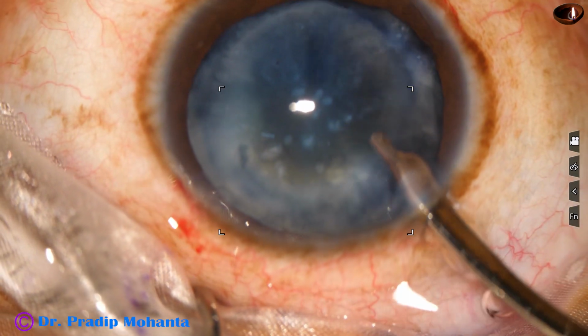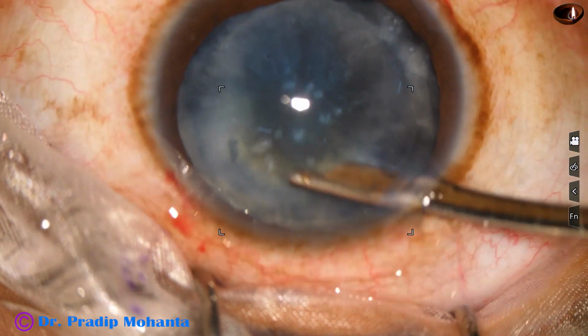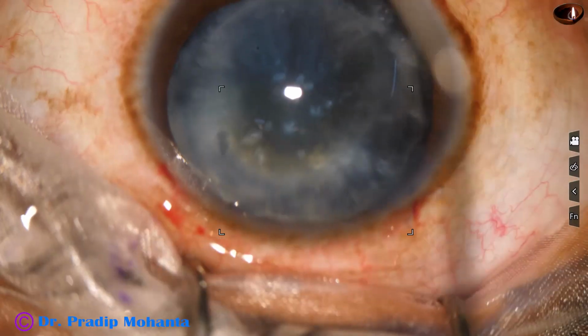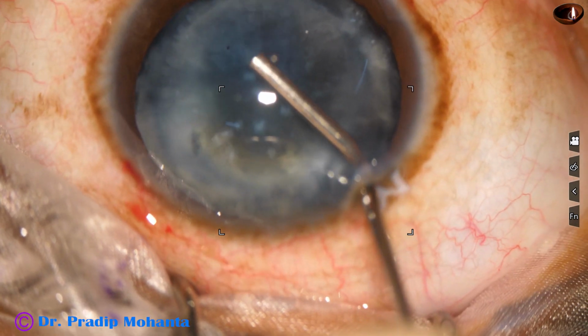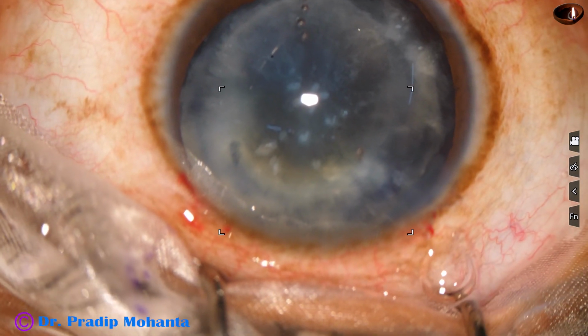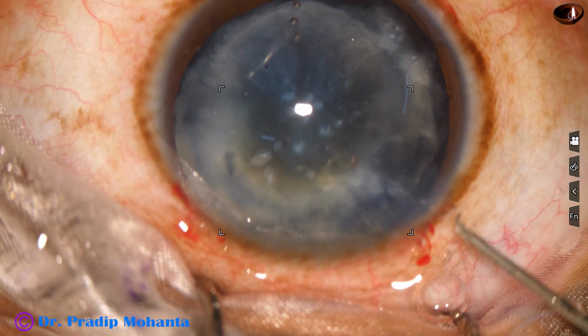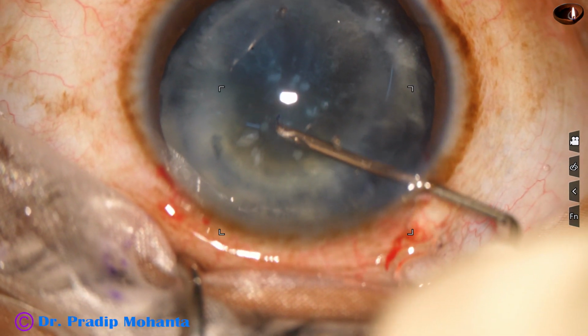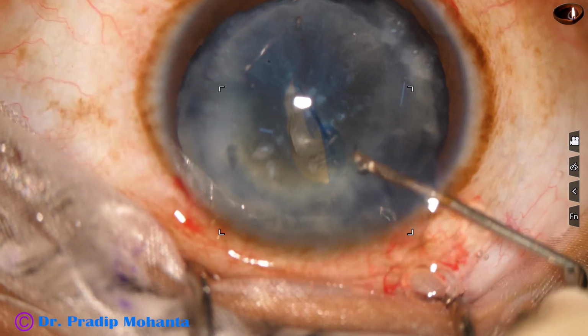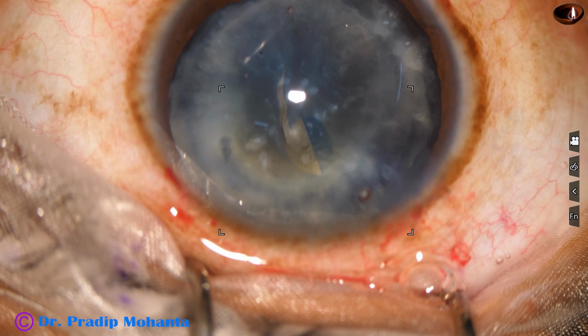The dye is washed out. If we wash out the dye, there is uniform density of the dye all around. If we don't wash, there may be more dense dye at some place, less dense dye at some other places, and that may cause some problem in visibility.